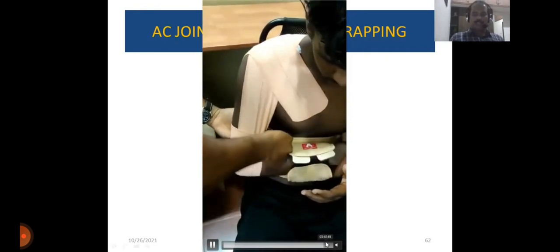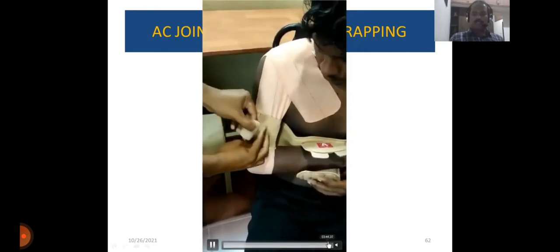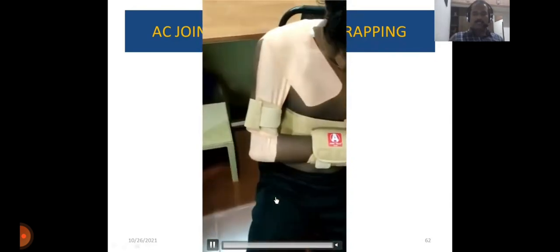After that, you have to use a shoulder immobilizer. You can use an elastic shoulder immobilizer. This is the elastic shoulder immobilizer, the brace used for completely immobilizing in a severe injury of the rotator cuff or a fracture. We can see a strap around the abdomen, a forearm strap and an upper elbow strap. So it is the elastic shoulder immobilizer with the joint strap.